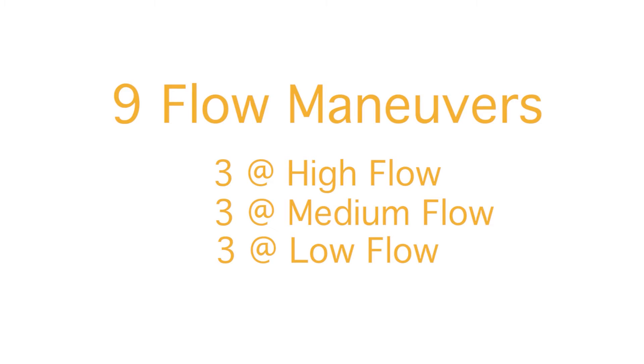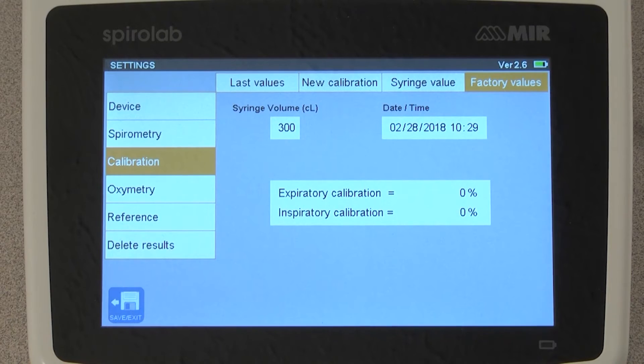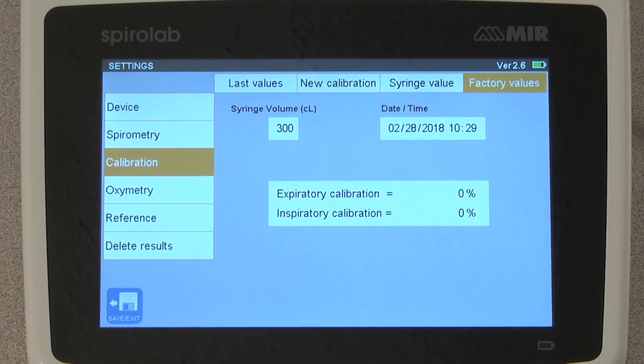You will be doing a total of 9 maneuvers: 3 at high flow, 3 at medium flow, and 3 at low flow. Now select New Calibration.